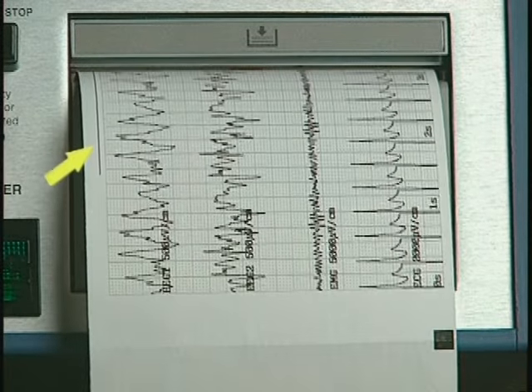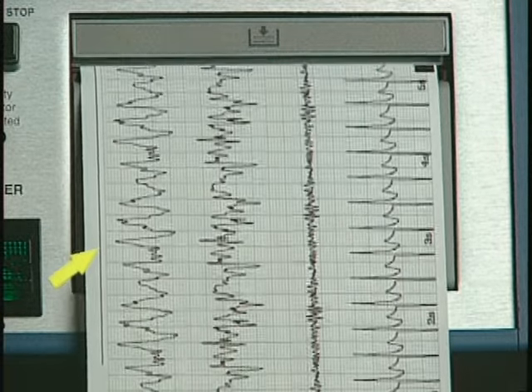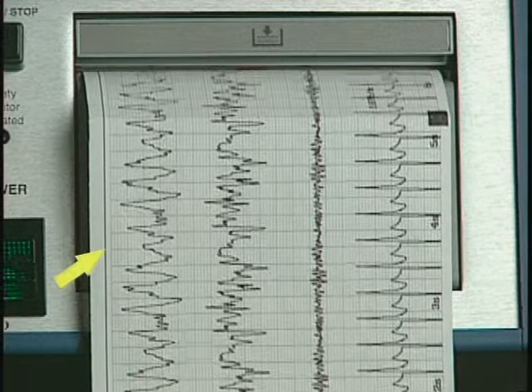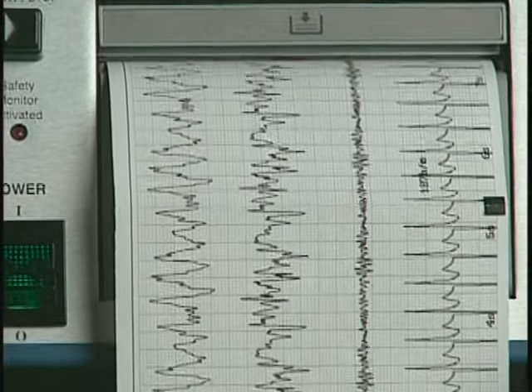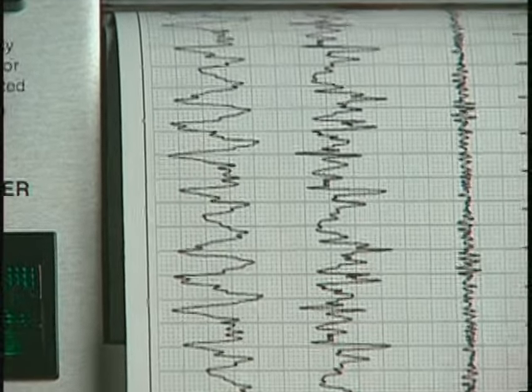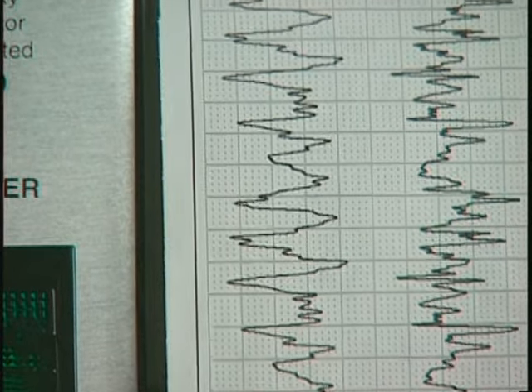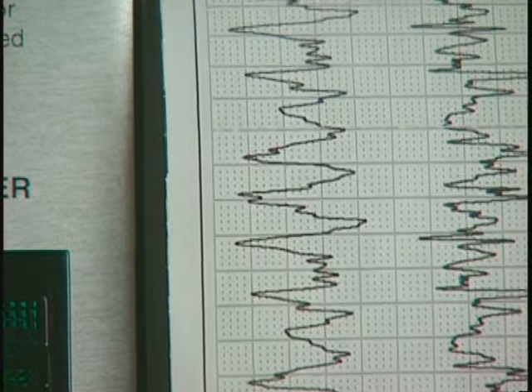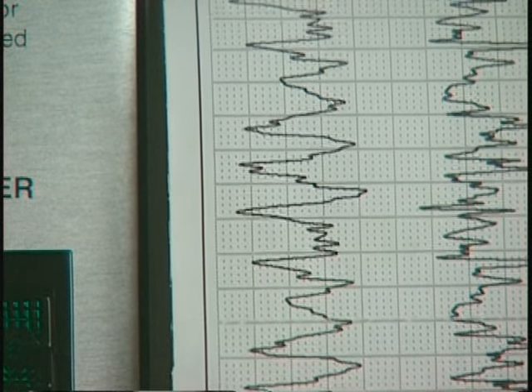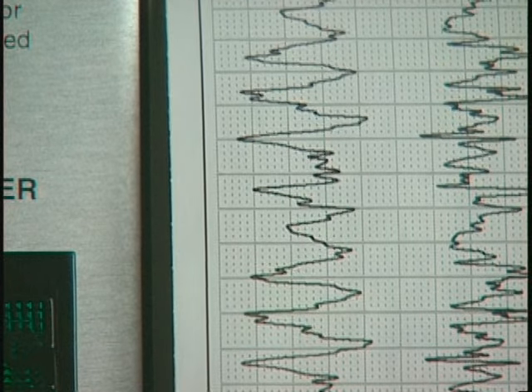If the baseline EEG sample has first been obtained as described earlier, signaled by the word Ready appearing in the display, a thin black line called the ictal line seizure indicator is printed along the top of the paper recording strip as an aid to seizure interpretation. Whenever the EEG amplitude exceeds a specified baseline value determined individually for each patient, an unbroken solid black ictal line seizure indicator appears at the top of the recording strip, reflecting continuous seizure activity.